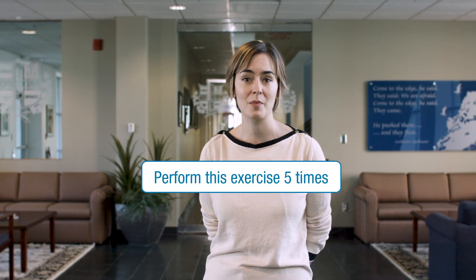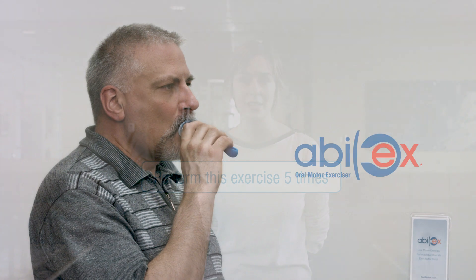Speech-language pathologists recommend that you work towards accomplishing three sets of each suggested exercise three times per day.